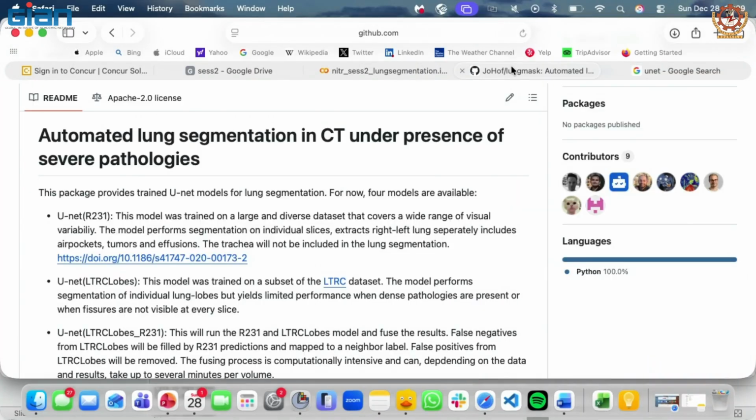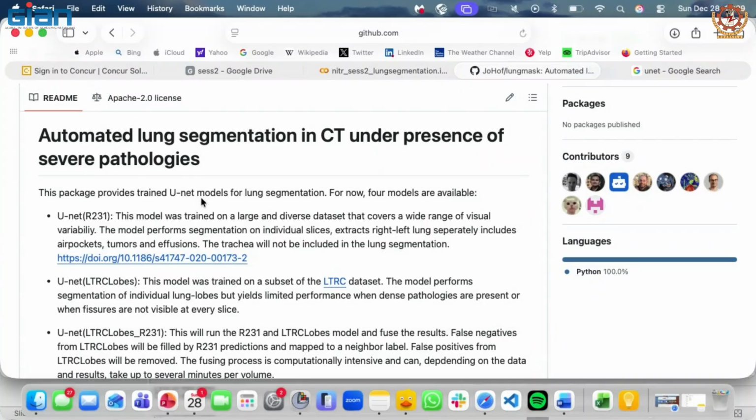It's a very simple architecture, nothing fancy, but with time people removed the convolutional based encoder and put a transformer based encoder, and that outperformed the normal convolutional encoder. But for a segmentation architecture, the U-Net structure remains the same. We will look at a very advanced U-Net, one of the very famous state of the art models, which you can readily use for your own segmentation purposes. Okay, coming back to lobe segmentation.